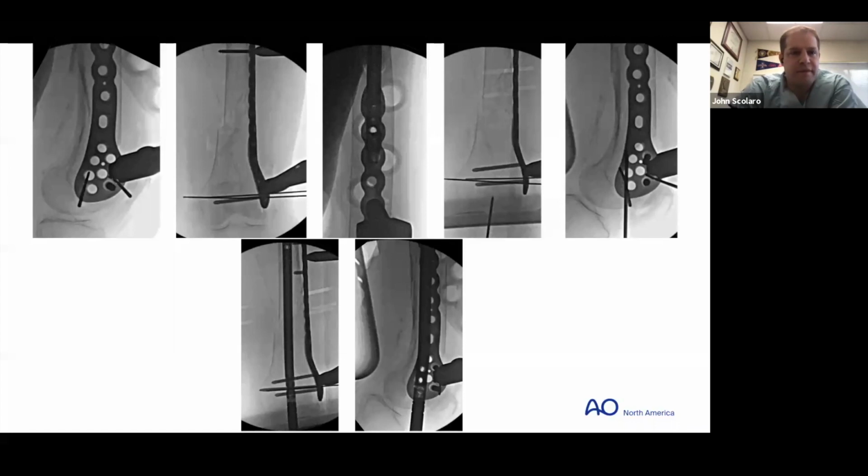Yeah. So for me, I don't want to mess around in an older patient with horrible bone quality in terms of removing implants, putting new implants in. I think my tolerance is probably at just removing an interlocking bolt, maybe one or two. With bone this cavernous, usually have opportunities for fixation around. And so utilizing a submuscularly placed plate through a limited incision, respecting most of the biology really around the fracture site, and then just using indirect reduction techniques to line things up.